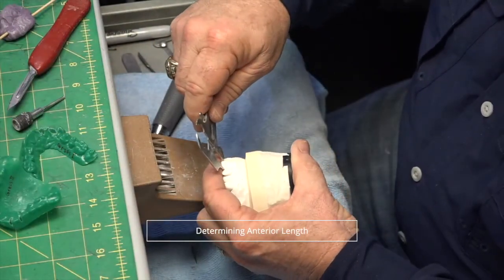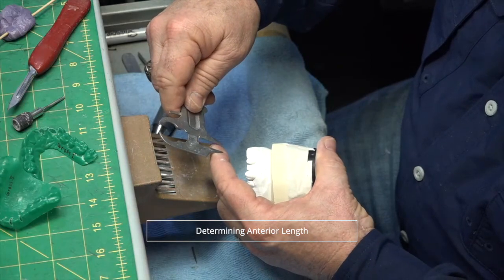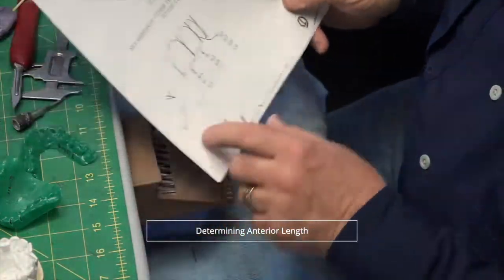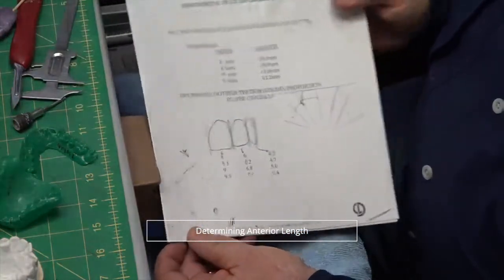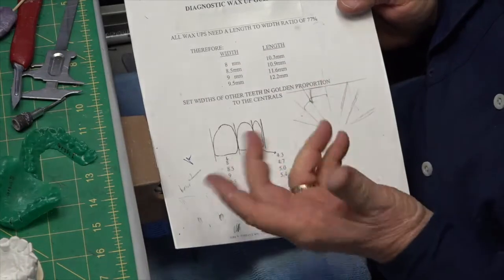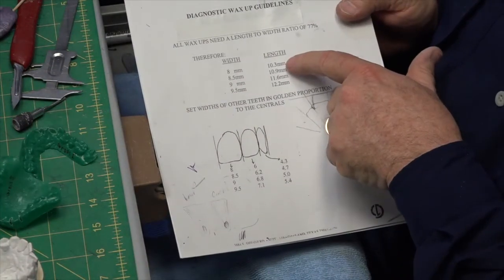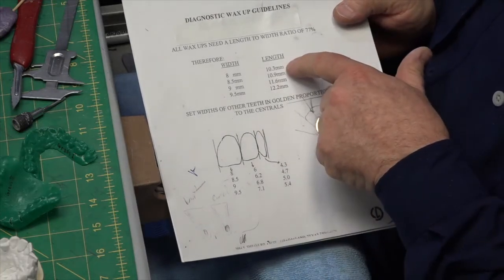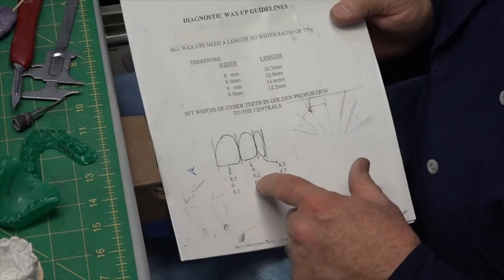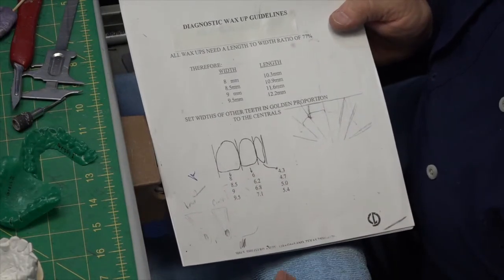If you look at the width of number eight, it's right at eight millimeters wide. I have a chart that I made years ago — you can tell it's well used. For an eight-millimeter-wide central to have a 76 percent length-to-width ratio, you need to be about 10.3 millimeters long. Generally you can't go that full length, but this is used as a guide based on the golden proportion. That's how this is set up and what I try to follow.